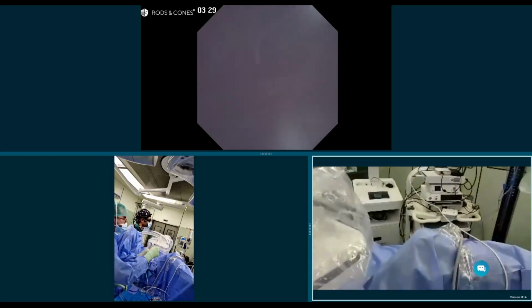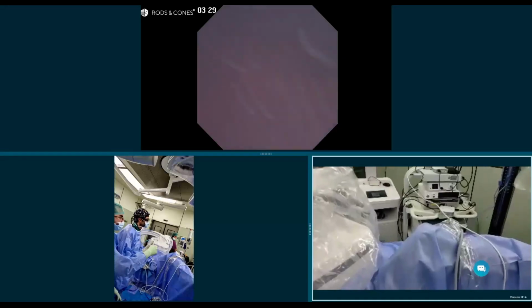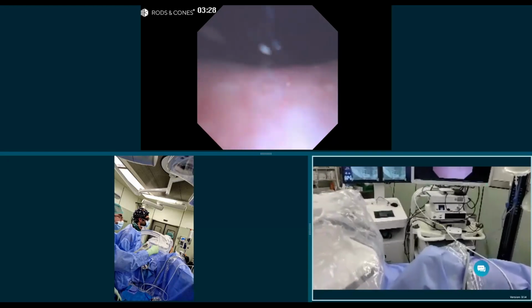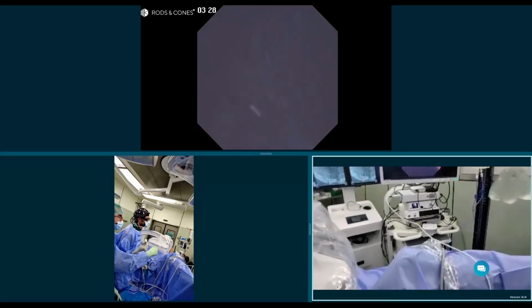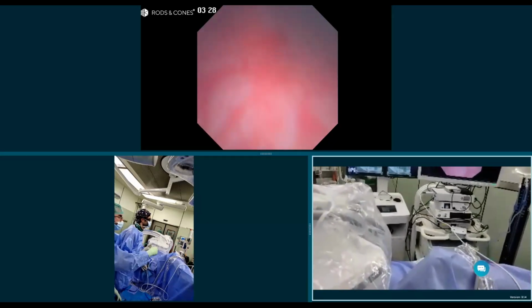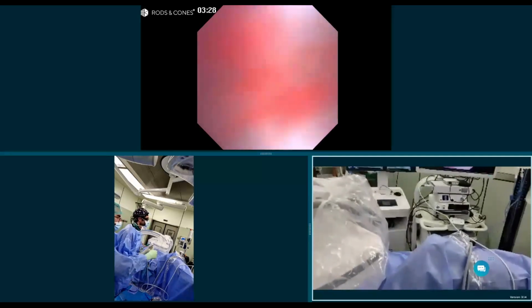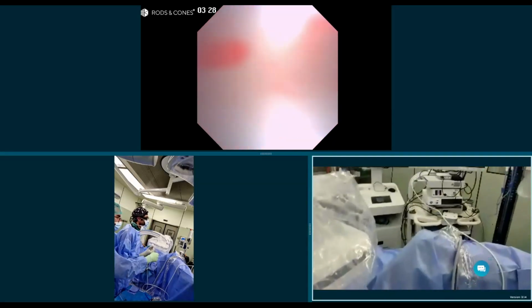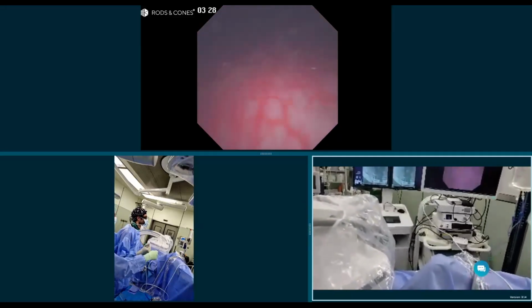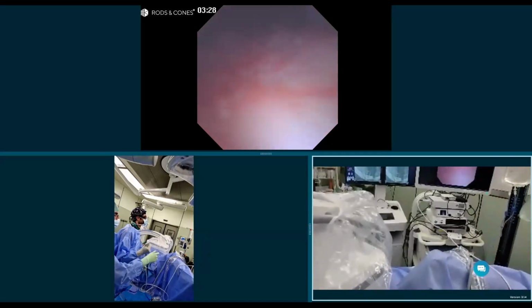Excellent. So if you ever have trouble getting into the ureter, this can be a good trick to use. So we go to the neck. We look for the orifice here. Again.